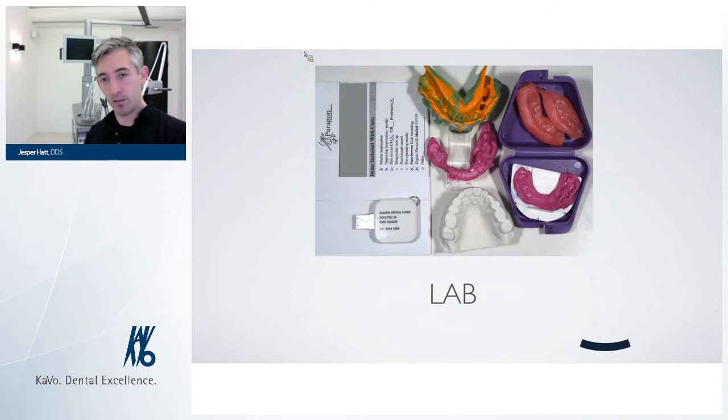Pictures on the USB disk, models, impressions, bite records, protrusive bite records for an individualized condylar angulation, and in this case a registration for the Panadent articulator. Usually we use a KaVo articulator, but we wanted to try this Panadent dentofacial analyzer by John Kois, to see if it would work in this regard. So that's one of the areas that we're testing at the moment.